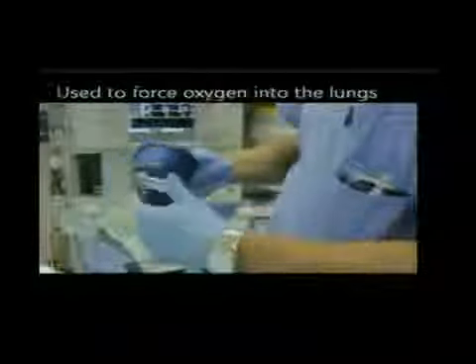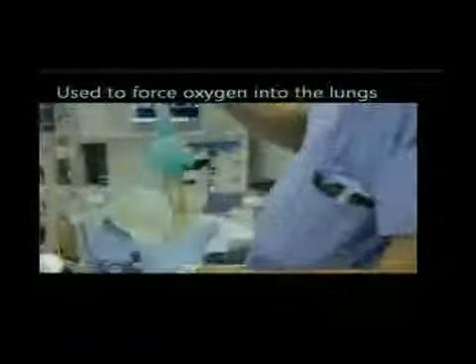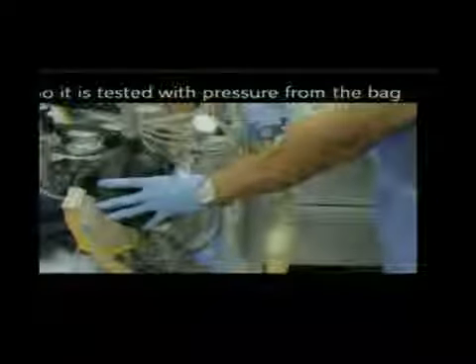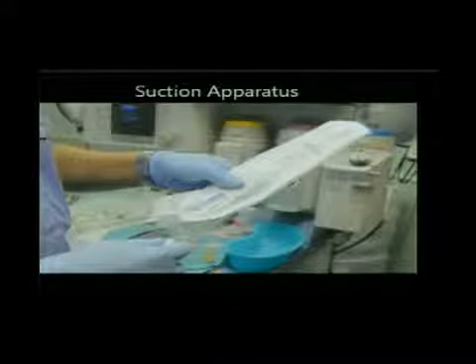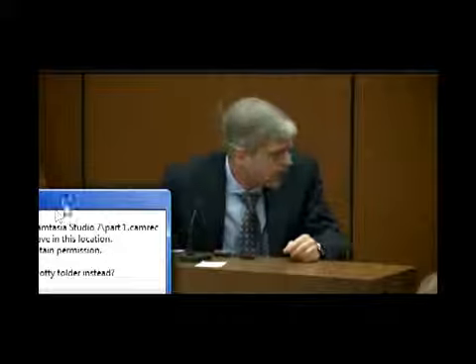Continue, please. So this is the anesthesia breathing circuit. He has put his finger there to block it. Why did he do that? Because he wants to see that he can maintain pressure. So he now squeezes it, and he can feel the air coming through the mask with his finger to verify that. Stop. So he verifies that you can squeeze the bag. An anesthesiologist always checks before every operation that you can squeeze a bag, and with the tubing that goes to your mask, you can force air into a patient who is not breathing.